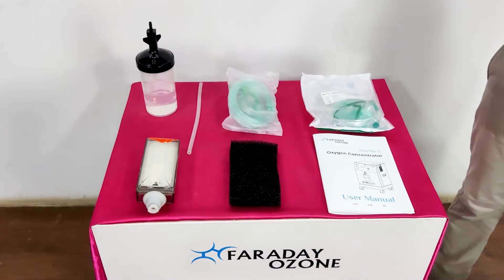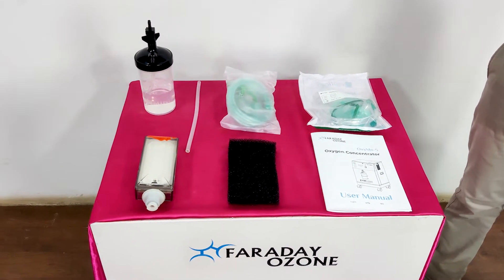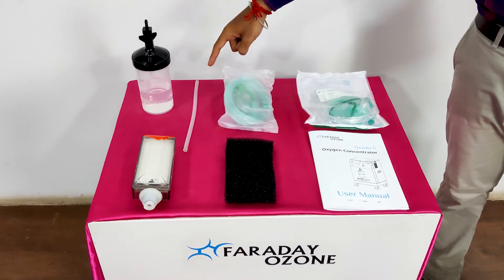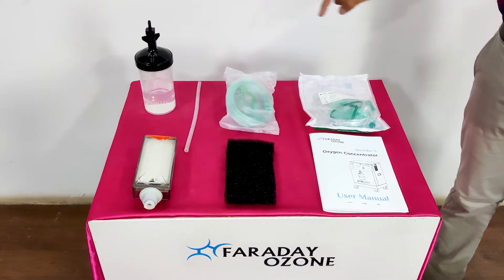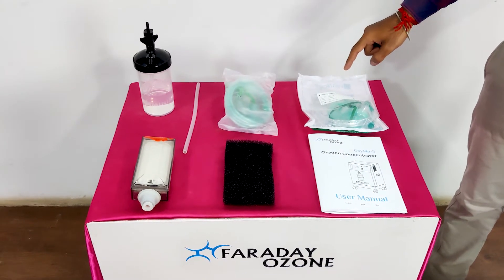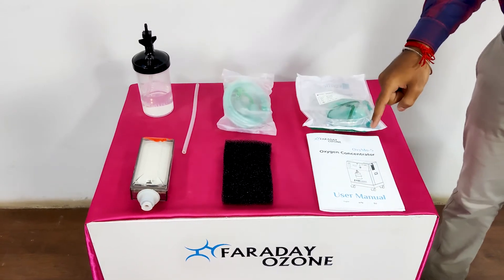This box contains one 5LPM Oxygen Concentrator and accessories like a Humidifier Bottle, Humidifier Bottle Connector, one Adult Nasal Cannula with Nebulization Kit, one Pediatric Nasal Cannula with Nebulization Kit, one HEPA Filter, one Primary Air Filter, and a user manual.